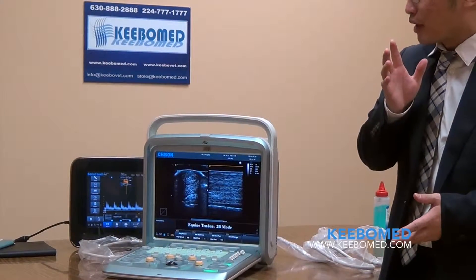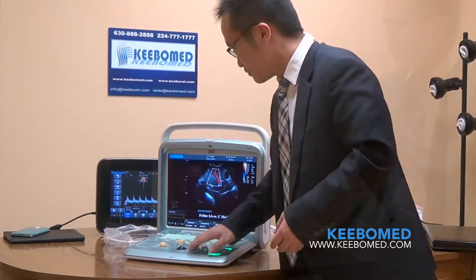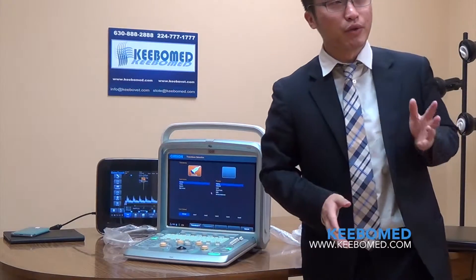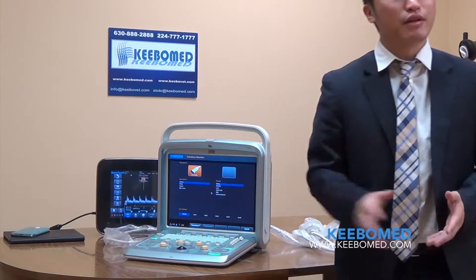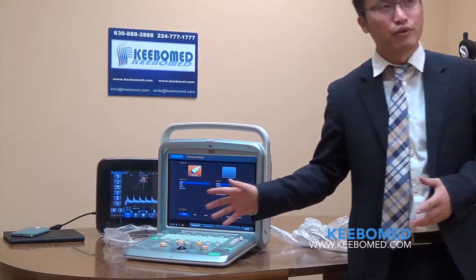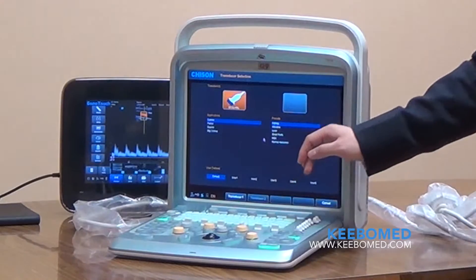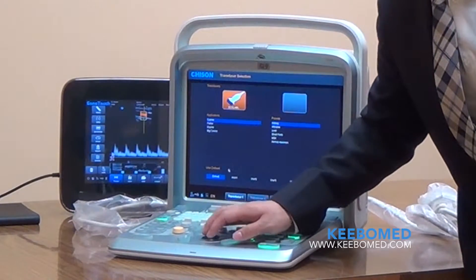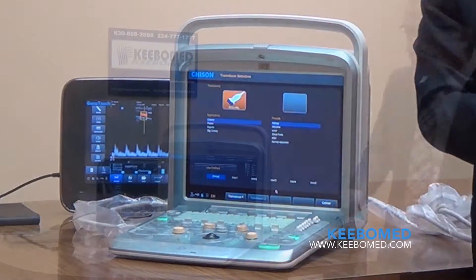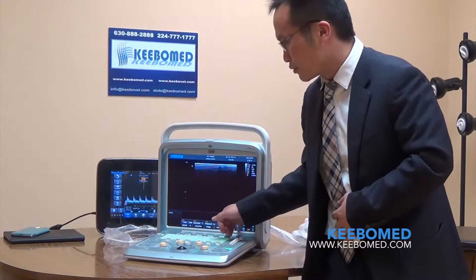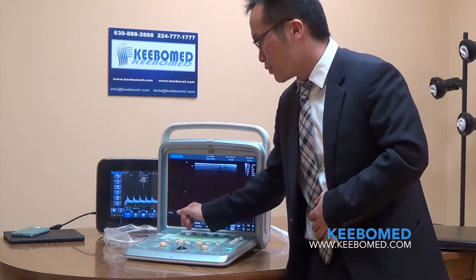Let me introduce some features and benefits for both the Q5 and Q9. Both are based on the Windows platform. Compared with Linux, the workflow is better for customers, and the user-defined options are very good. For example, this system has different applications and different presets. For each preset, we also have five user-defined presets, so it can be used by five different doctors. You can see the image size and parameters shown here, and there is a small area to save images and memory.